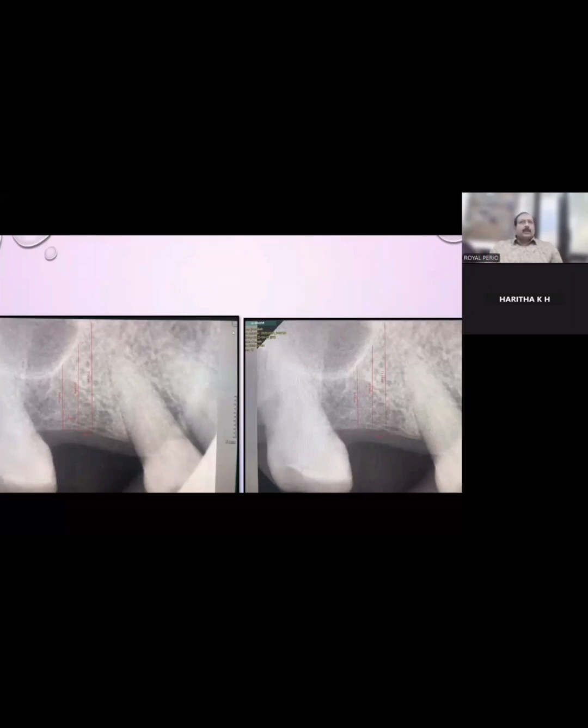So do you want to go in for your last drill and then place the implant, or one drill short? One drill or two drills short, according to how you feel the bone. So 6.5 is fine. Since you're planning for a diameter of 4.25, however long you drill, the drill has to stop at... 4.25 is your implant diameter. 3 to 3.5. Which all drills do you have? 2.8, then 3, then 3.5, then 4 and 5.